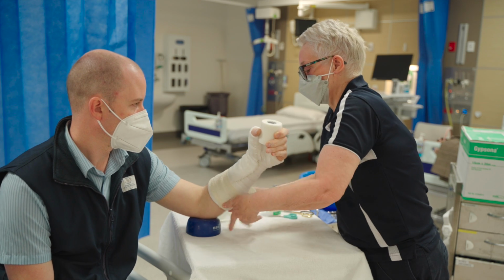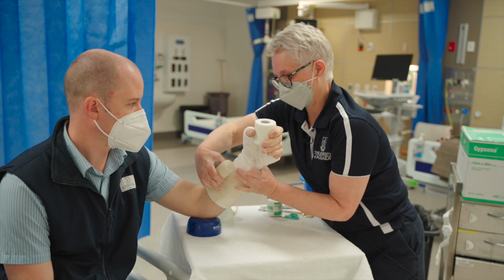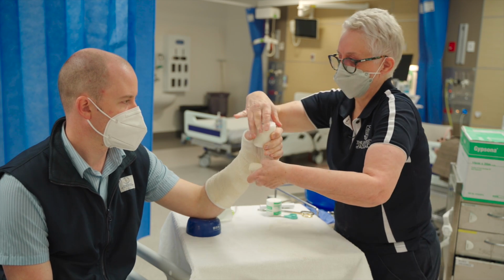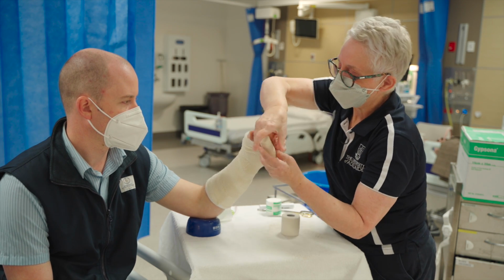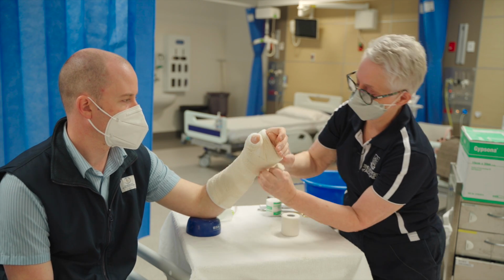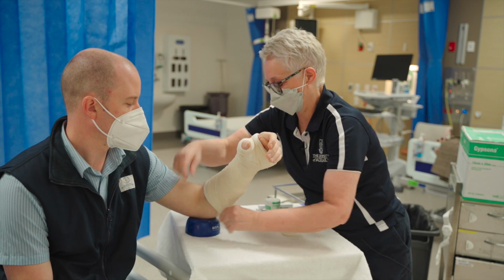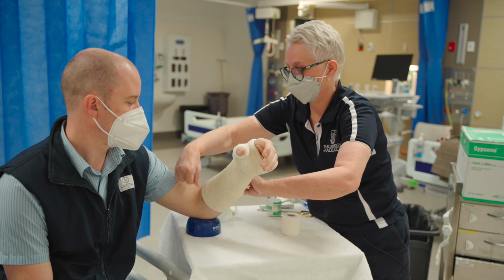Start with the bandage and start working your way up, making sure you've got an adequate tension to hold that back slab in place. Remember, a back slab is a supporting slab that helps to keep the fracture in place and reduce pain. So come on up through that space, around the thumb, and back down. Like so. Last piece of tape on there, just to hold that in position.